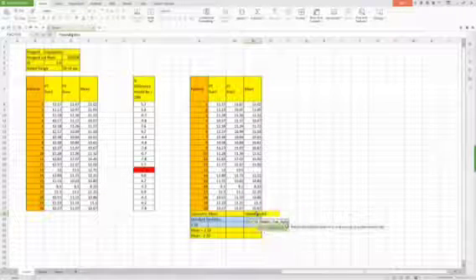In our example, one set of values shows 12.5% difference. Exclude this one. Then, the geometric mean of all the 19 accepted mean values can be calculated by inserting a simple formula on your Excel sheet. In our example, it comes out to be 11.25 seconds. Now, calculate the standard deviation on the 19 sets of means by inserting a simple formula on your Excel. Standard deviation in our example is 1.51.